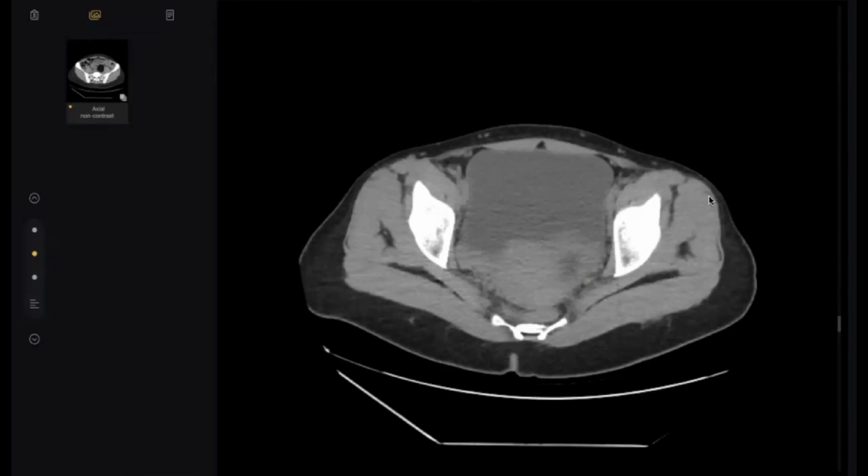Doctor, do you know the difference between dermoid and the sebaceous cyst? In sebaceous cyst, it is in superficial subcutaneous tissue. I'm talking about the pathology. There is a good pathological difference.